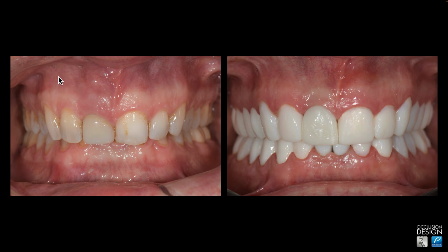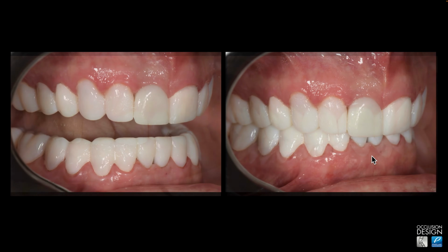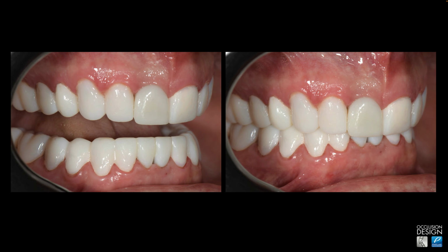You can see his 100% overbite before, and you can see the changes in his occlusion with the design that we did. So he has a big occlusal change that we want to test out for a period of time. Usually, 1 month is a good amount of time. If you're really having questions about whether the patient can adapt, you can go up to 3 months, and that works as well. I think we get the design dialed in quite nicely.